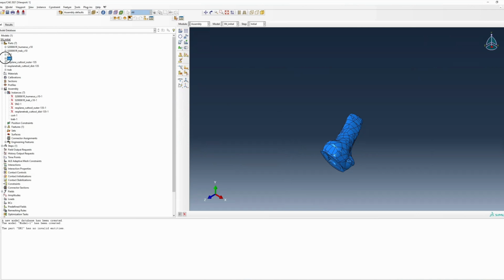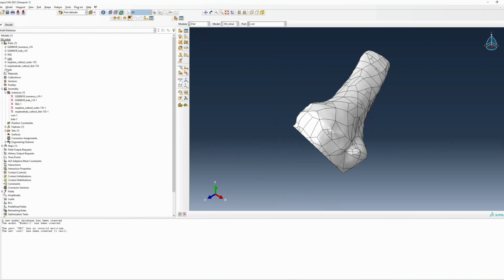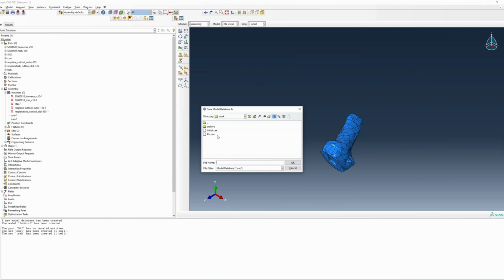After you've isolated your trabecular and cortical bone models, ensure that they're cut with your implant, and also double check to make sure that you create a cortical and trabecular set, as this will be very important in the future. Also, make sure that you're saving very frequently, as Abaqus is not very forgiving when it comes to undoing actions.